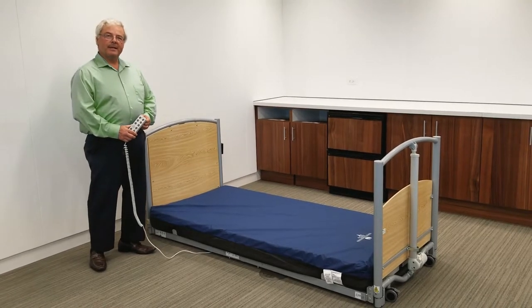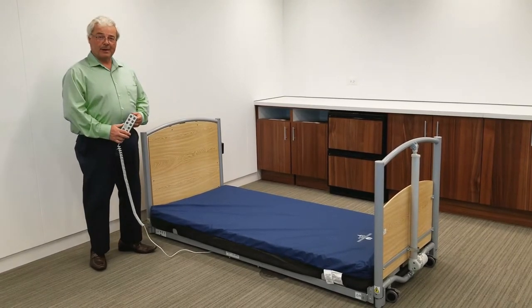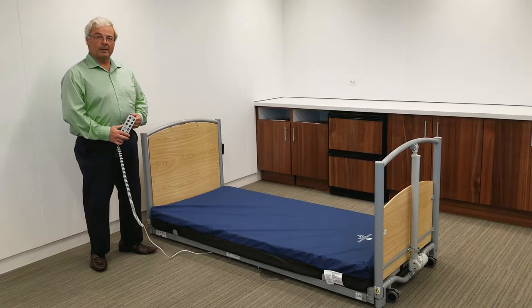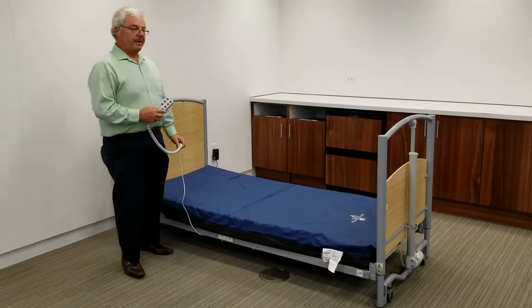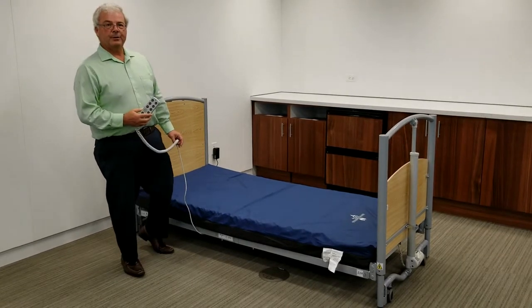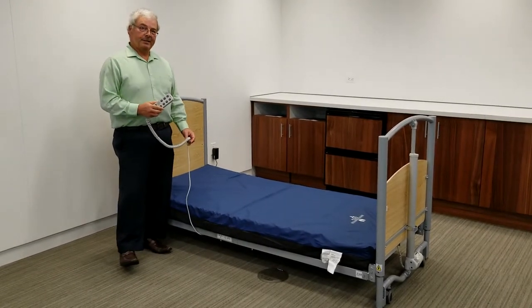The floor bed is fully compliant with the latest safe patient handling anti-entrapment code 60601-2-52. Now we're going to talk about safety. The main purpose of the floor bed is to eliminate falls and the injuries that falls produce.